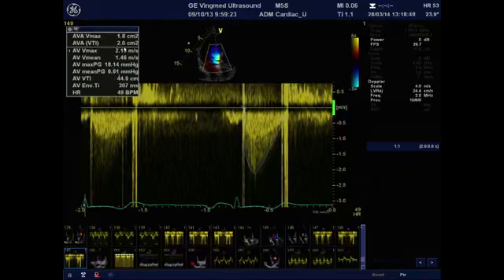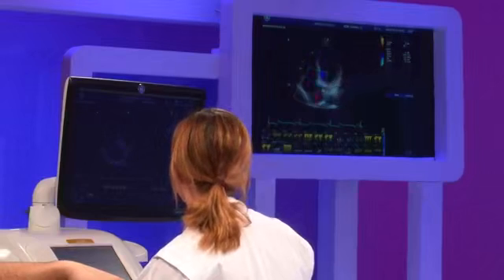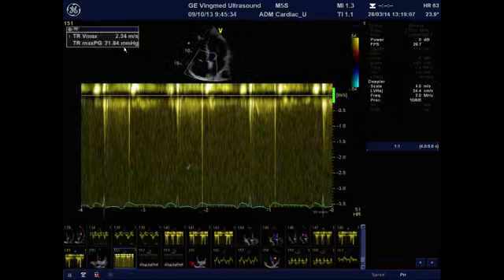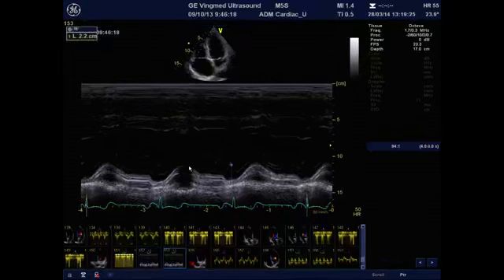And here in that view we obtain by the continuity equation an aortic valve area of 2 centimeters square, which is completely normal. Then you should quickly assess some important repercussion that you can find in the case of significant pathological leakage. You should assess the pulmonary pressure using the transtricuspid gradient. So simply, as you all know, you just take the max velocity of the continuous wave Doppler on the tricuspid regurgitation. You can also quickly assess the right ventricular function using the TAPSE with the M mode.